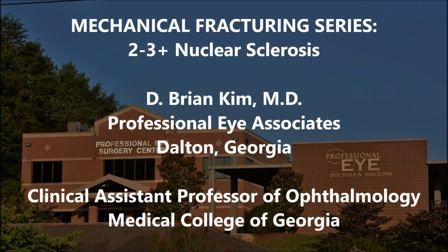Hi, this is Brian Kim, and this will be the first of a series of cases I'm going to share with you that breaks down a double-chop, cross-chop, and all the mechanical fracturing that I do to break down, disassemble, and emulsify the lens. Today we'll be discussing the 2-3 plus nuclear sclerotic cataract. I'll show the case in its entirety, and then we'll go back and break it down in slow motion.